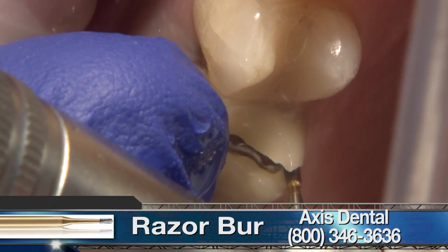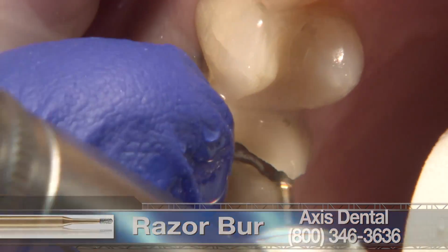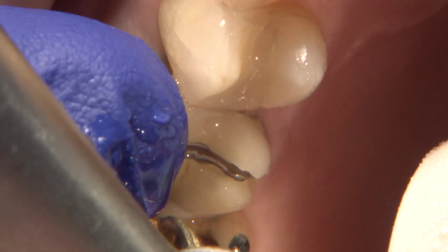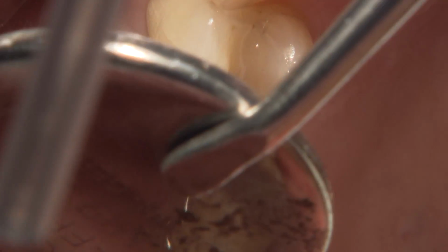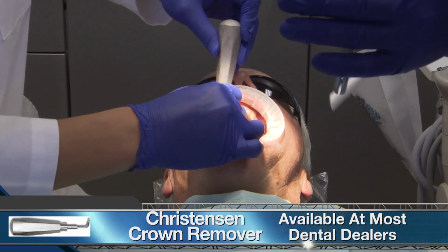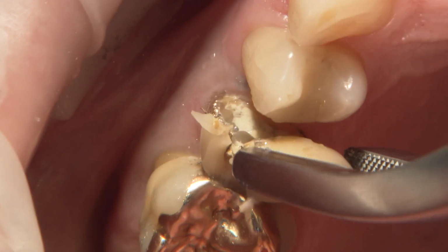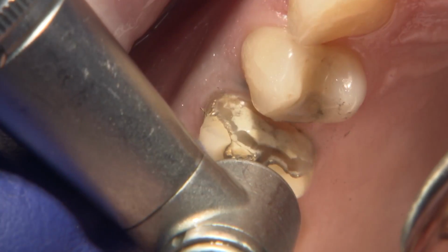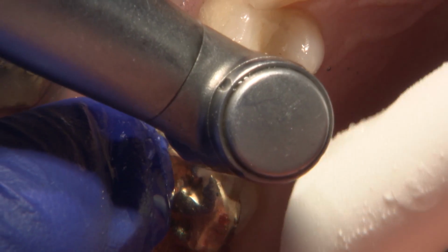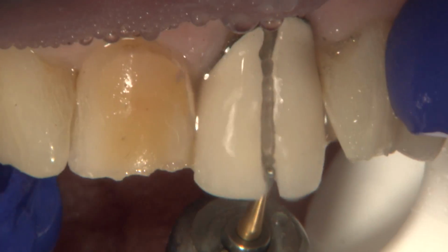Here I'm using a razor carbide burr to cut through the crown on the buccal, lingual, and occlusal on number 4. And this just allows us to section it off. Once the depth cuts are made through the crown, I'll use a Christensen removal tool to remove the sections off. And here the distal side was a little bit more stubborn. I had to add another groove along the occlusal to section that a couple more times.